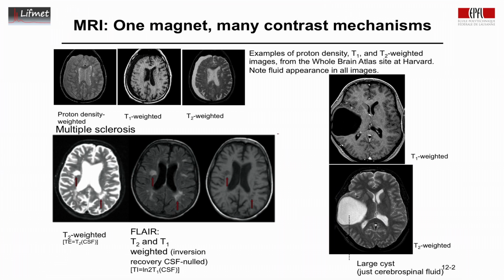What then happens is that these lesions here in the brain tissue, the signal changes appreciably compared to the brain tissue, and there's substantially more contrast to noise ratio. Here the signal to noise ratio is substantially better, but here the contrast to noise ratio that distinguishes these demyelinating lesions from the normal appearing tissues around them is much easier detectable.